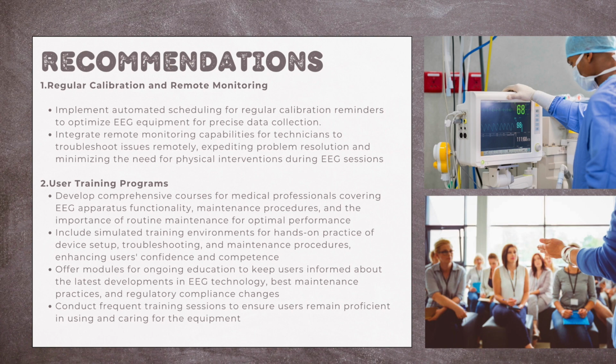Recommendation 1. Regular calibration and remote monitoring. Implement automated calibration reminders to optimize EEG equipment and integrate remote monitoring for quicker issue resolution during sessions. Recommendation 2. User training programs.